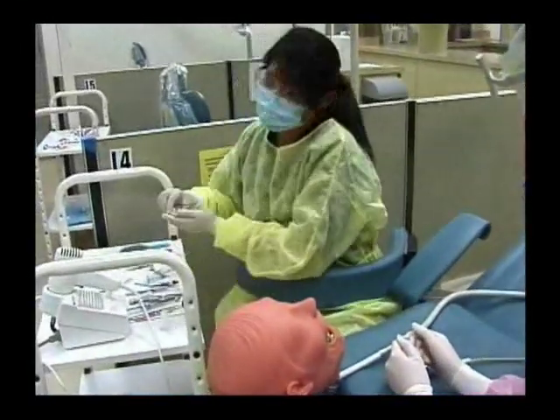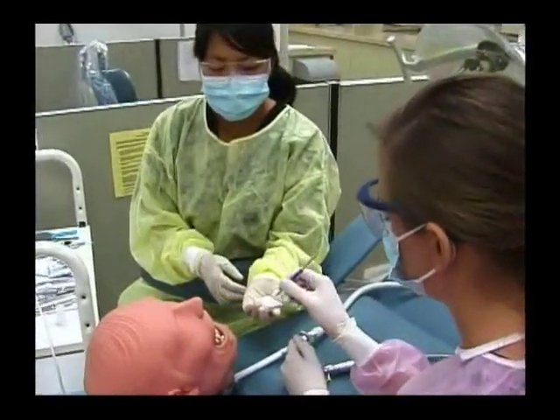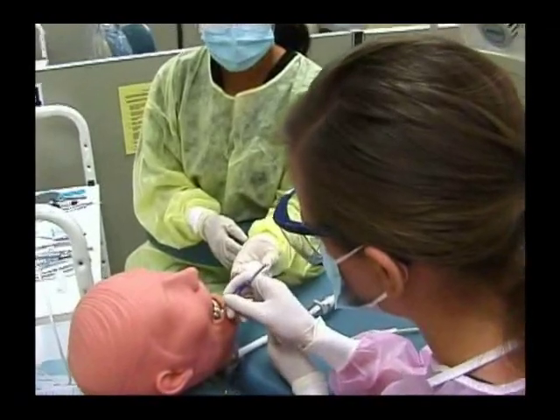Then we'd place Dical, which is calcium hydroxide, into the cavity preparation.